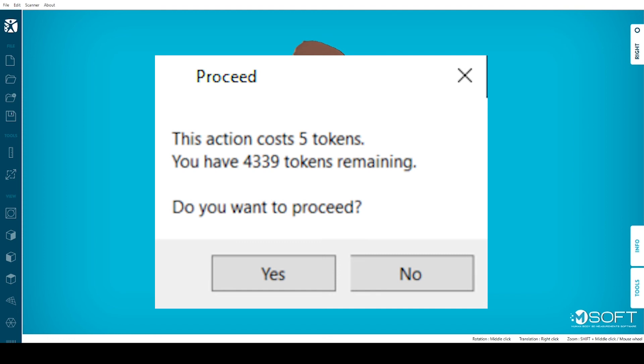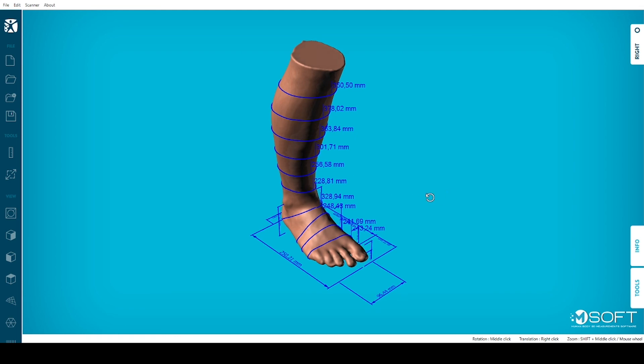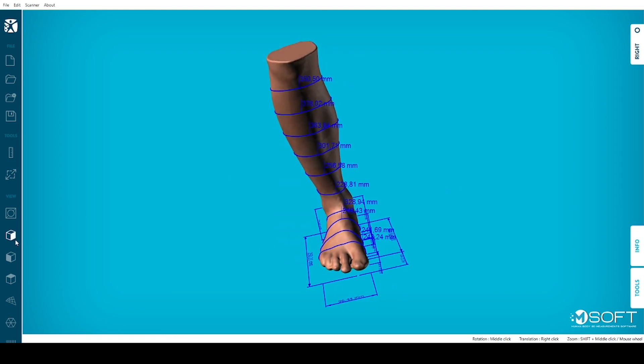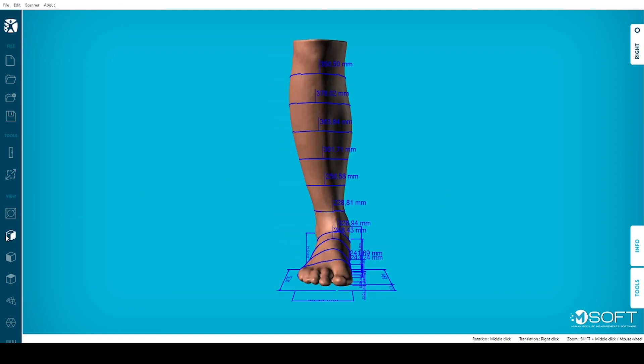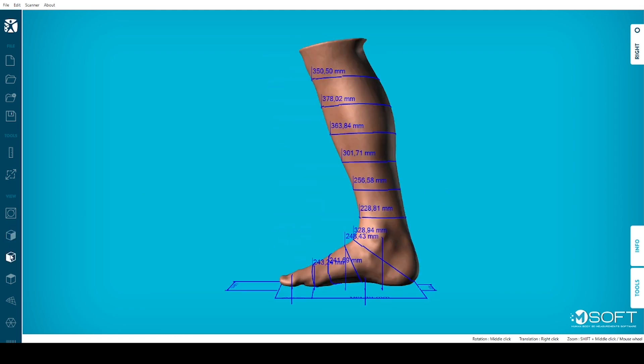M-Soft will indicate how many tokens you will need and ask you to confirm the transaction. After accepting, you will have access to the Measurements section. You'll also be able to save your file in the format and folder of your choice.